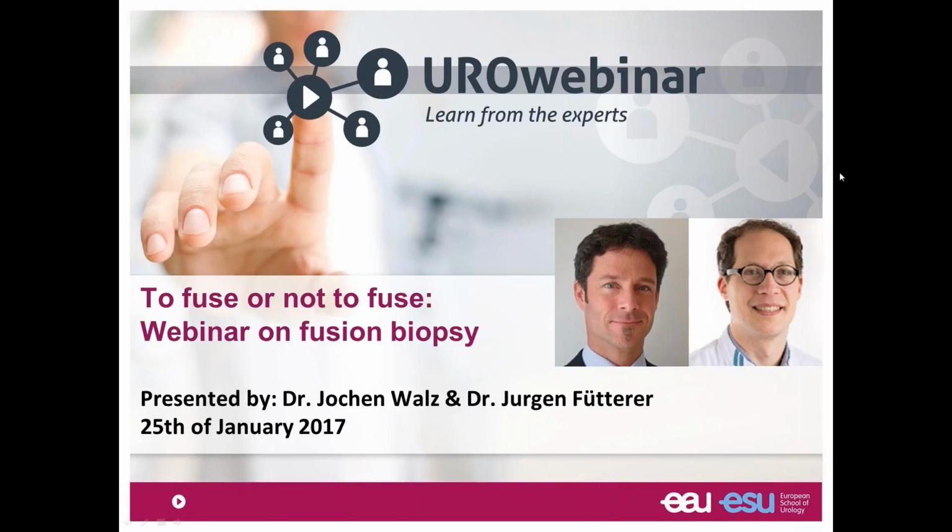I think the other thing is that if you do these kinds of MR targeted biopsy approaches, you always have to look back at what the pathology results show and compare them with the MRI results. In this way you can improve yourself and also have a way to see what your NPV, your negative predictive value, is with your MRI. Because as Jochen already mentioned, the MRI quality may differ between centers. So it is very much recommended to discuss that with your radiologist and get feedback on both sides to improve both of you. That is a very important point.